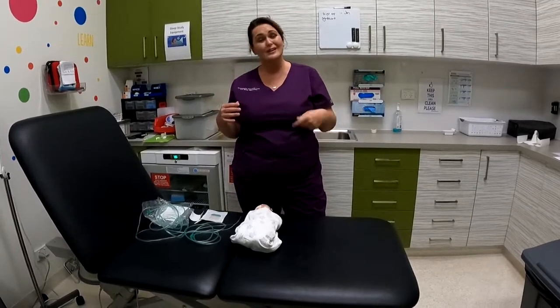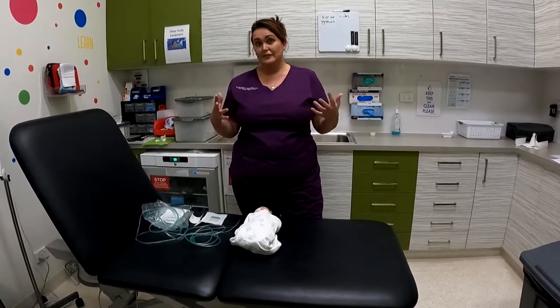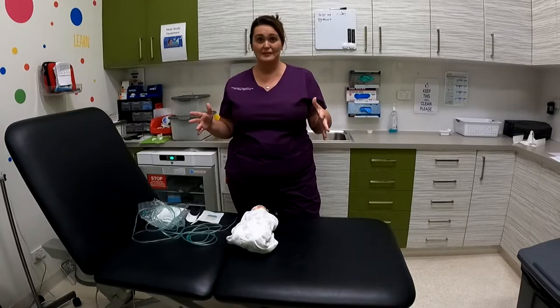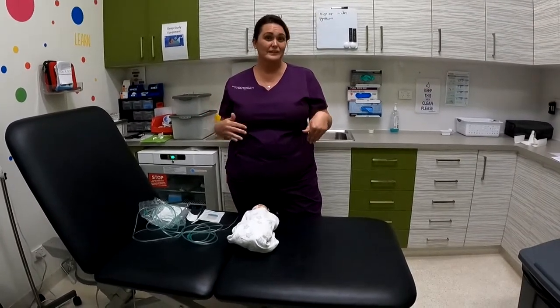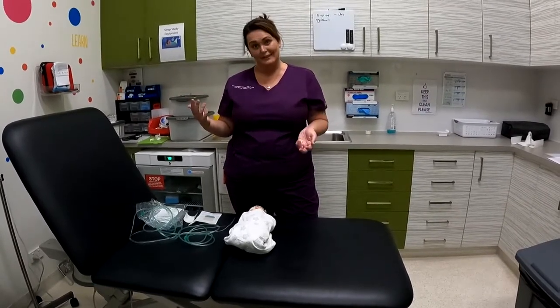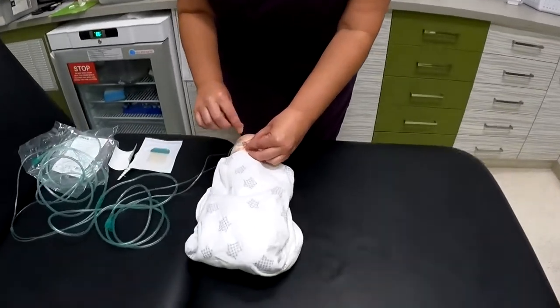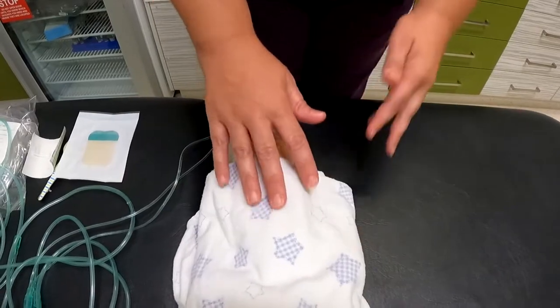When you get home, you can continue to use those saline drops, or what can be easier is if you purchase a saline spray. One that I really like is called Flow Baby, and you can purchase that from any chemist. A lot of the pediatricians will actually write up Flow Baby for you on your discharge medications as well, and it will be given to you by pharmacy before you leave the hospital. Basically, you just want to gently pull the prongs out and do one squirt up each nostril and then put the prongs back in your baby's nose.